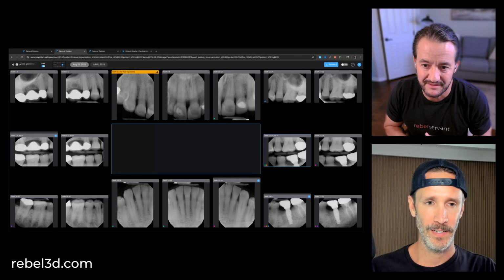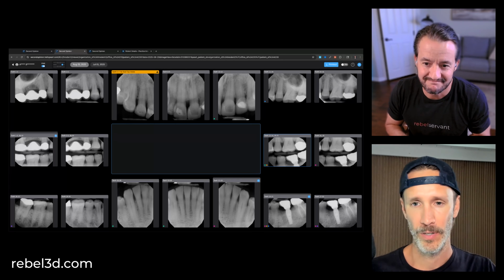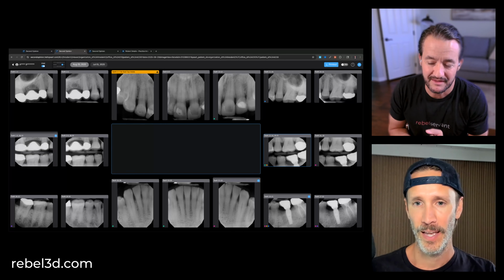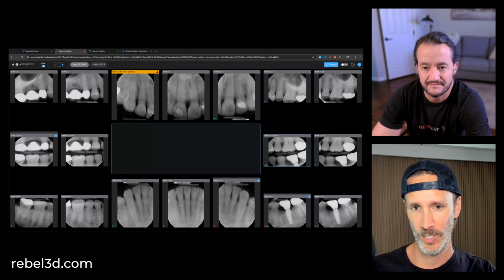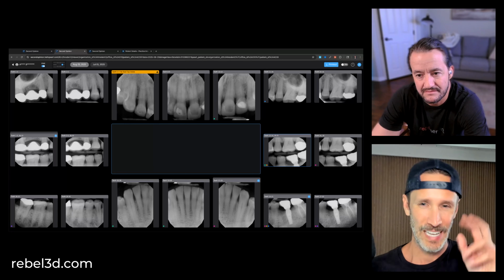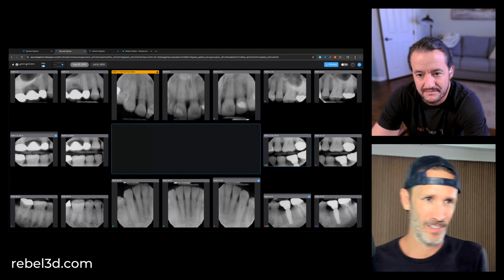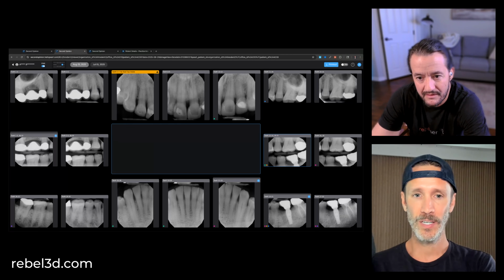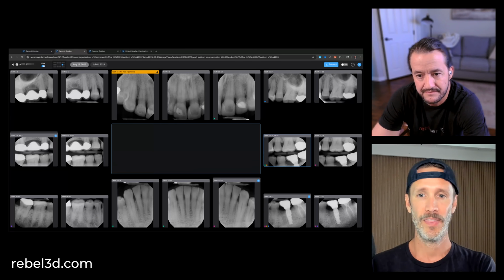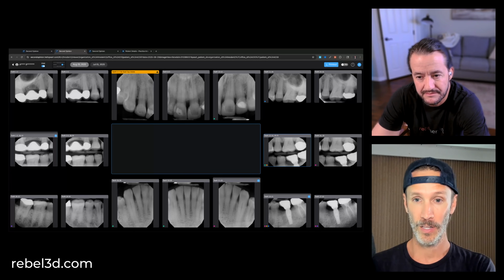I love the idea of reducing stress for doctors. That's something that I'm super passionate about. If anybody follows me on Instagram, that's a lot of what I talk about. And this is one way to reduce stress for doctors, because we don't love to sell. Most are pretty bad at it. And that's even like a slimy, ugly word in dentistry. So when you can educate and show a patient and they see it, I think it reduces a lot of stress for my colleagues.